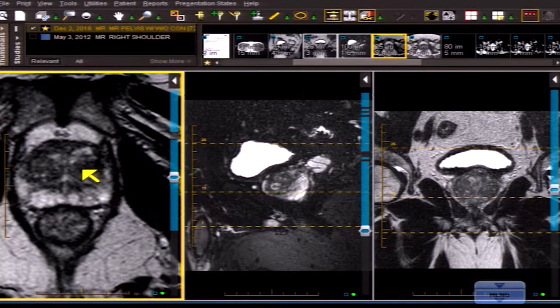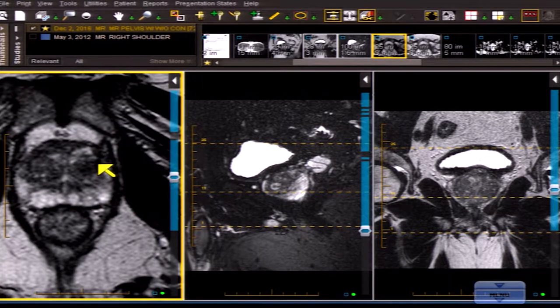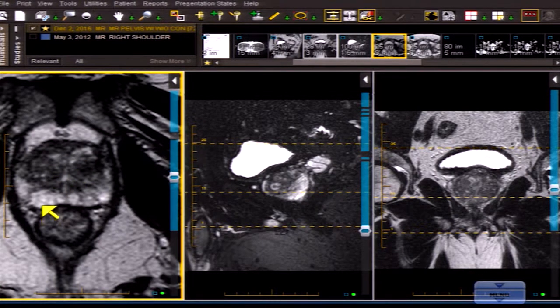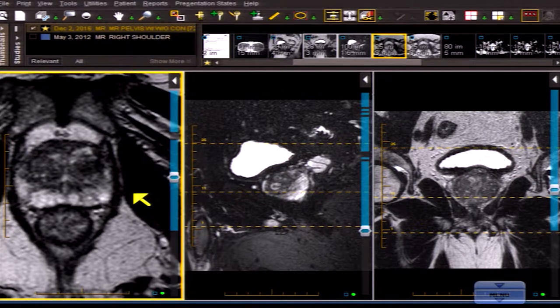A nodule corresponds to a nodular form of mass — it's a subtype of mass: a small, rounded clump or swelling. I like to define nodules as either fully encapsulated versus poorly encapsulated, because from a prior vignette we said that if BPH nodules get really tense and full, they can extrude into the peripheral zone and look like cancers — but they have a nice capsule around them.